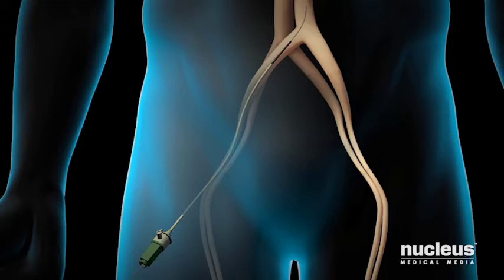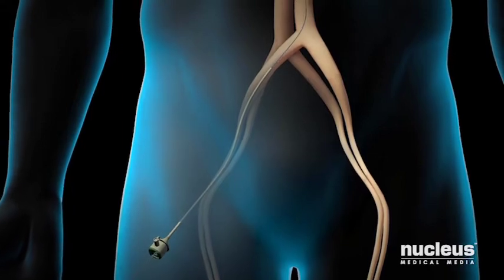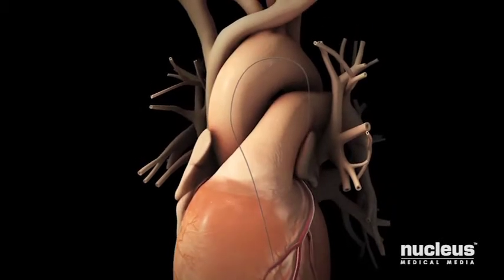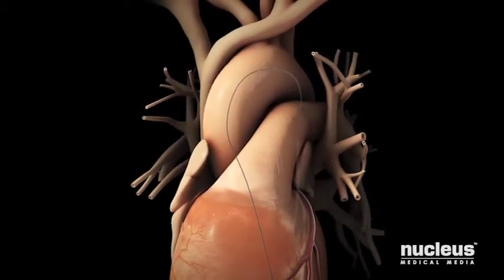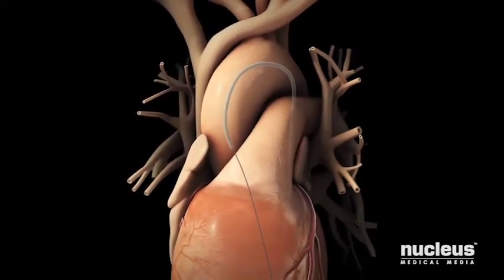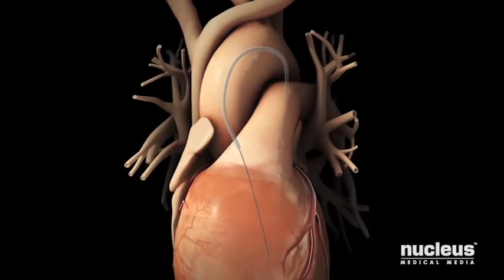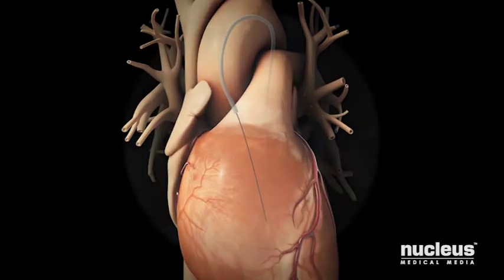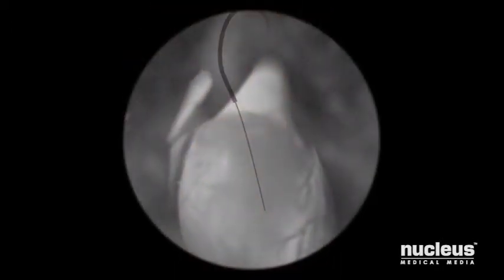You may feel pressure when the doctor inserts the sheath through the skin into your body, but you will not feel the movement inside your artery. Next, the guide wire will be advanced up to your heart. A flexible tube, called a catheter, will be advanced over the guide wire and brought into position near your coronary arteries. The procedure will be monitored using an X-ray imaging device called a fluoroscope.